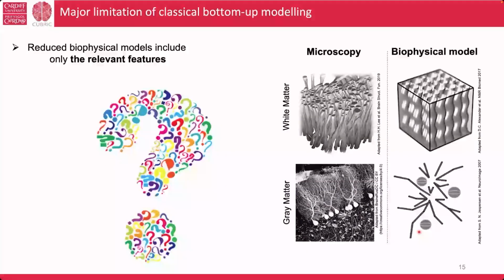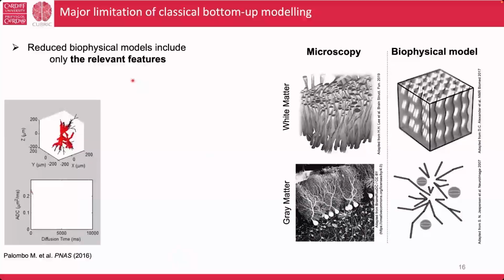However, nowadays we have tools like a lot of electron microscopy data and high-resolution microscopy imaging that can help us identify these relevant features.